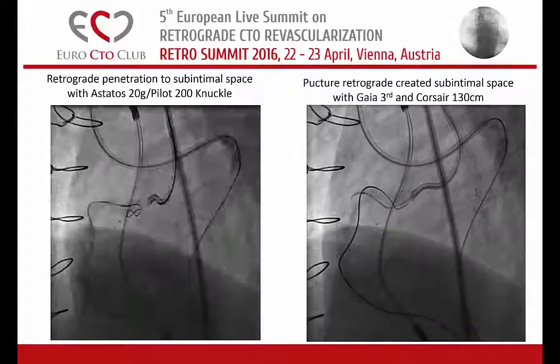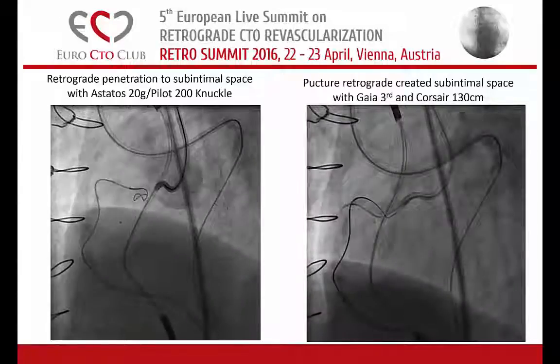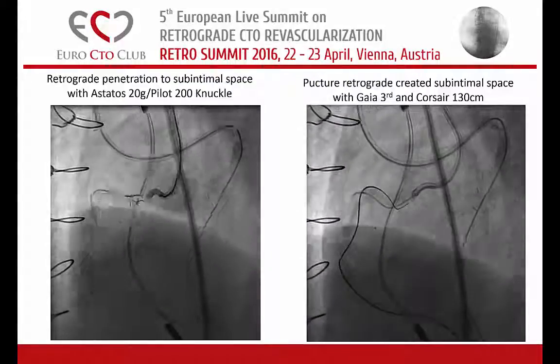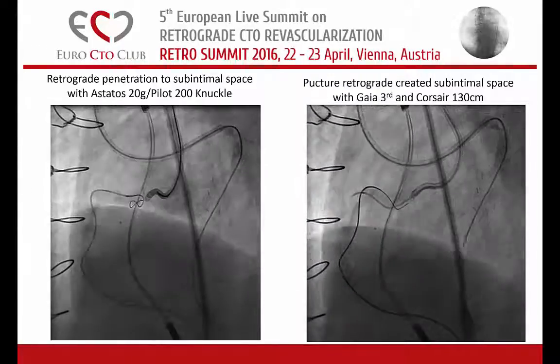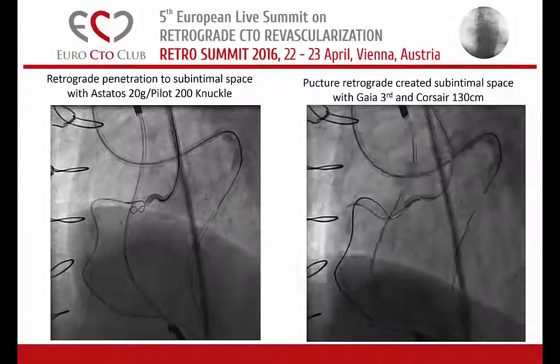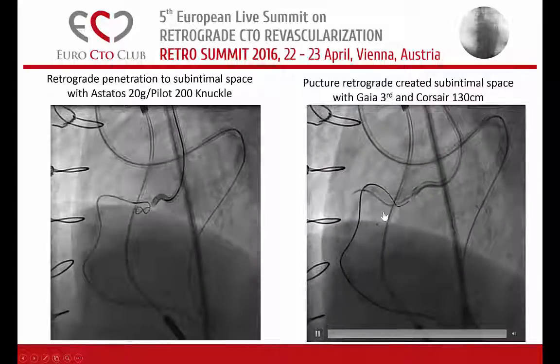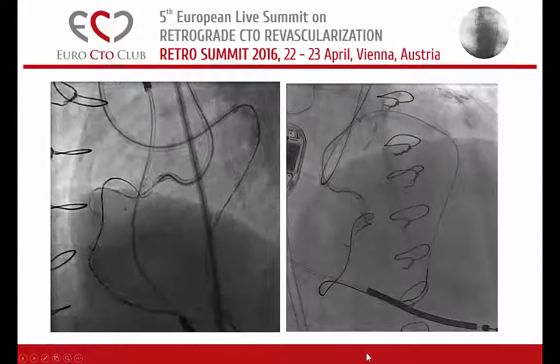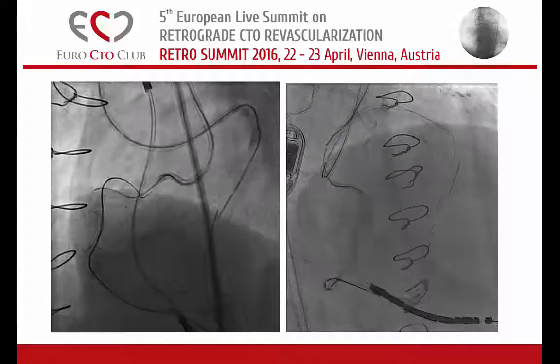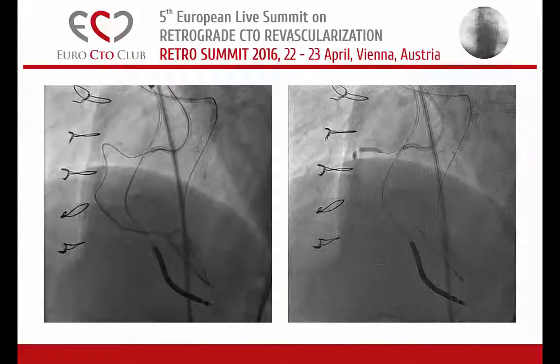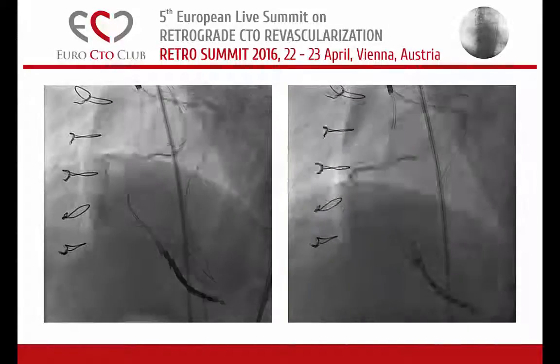So I tried to create a retrograde knuckle to create some space there, with the hope that I could enter this created space with an antegrade device. It worked — I could puncture with my Gaia and then the Corsair could follow. As you can see, at the proximal part it's probably the same space, and then I went around with the Corsair around the calcium. I took an antegrade Pilot 200 to go down, and in the distal part I had a kissing wire position. I was so lucky that the Pilot just went down. I had a kissing wire position and I solved the case finally with antegrade.